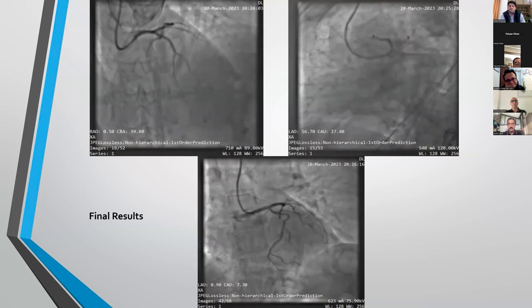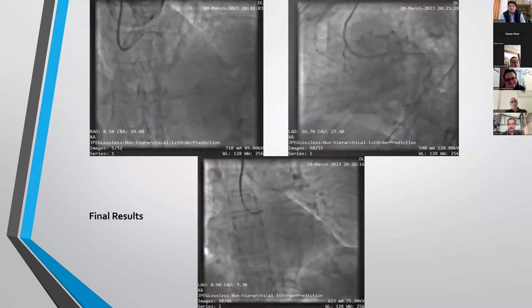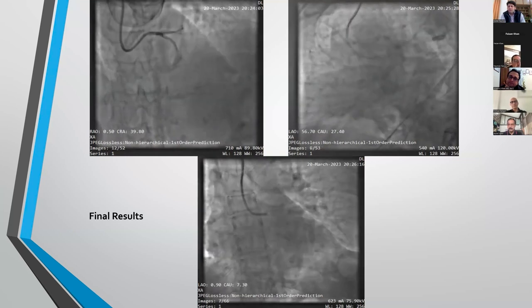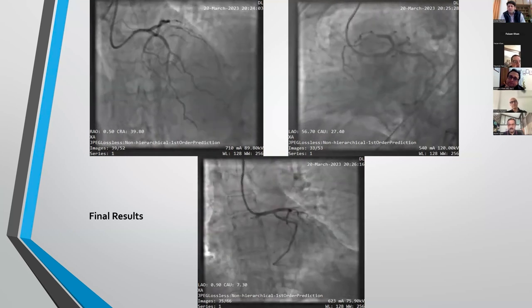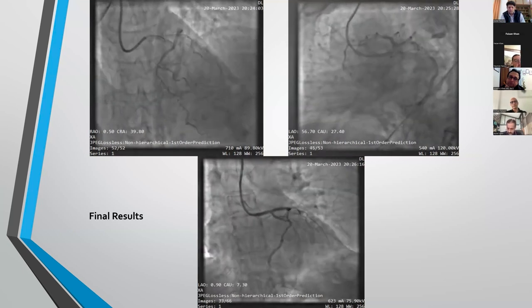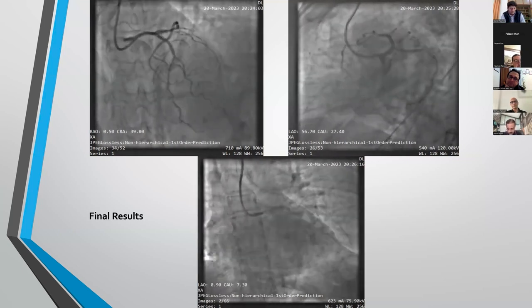अगर कोई borderline है और जरा sure नहीं हो, तो you should confirm it with physiology. जहाँ तक committing to revascularization for left main hai, so I think physiology is probably a better way to do it. You can safely defer based on imaging.